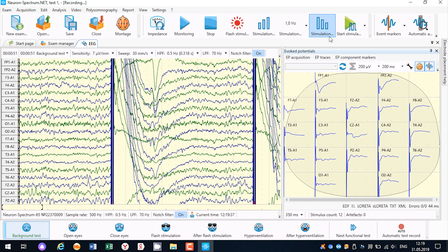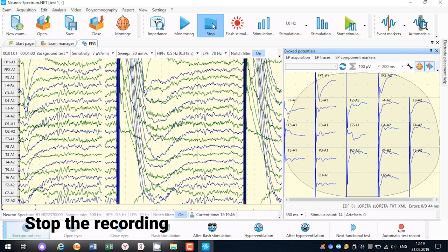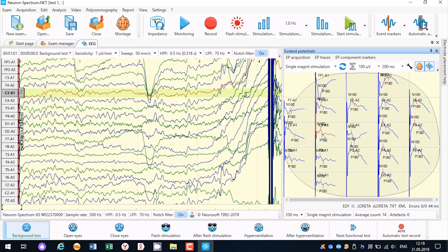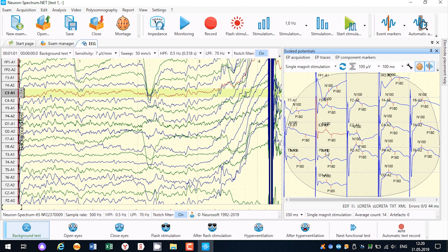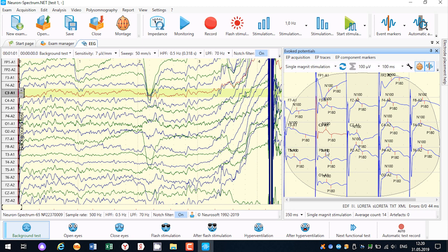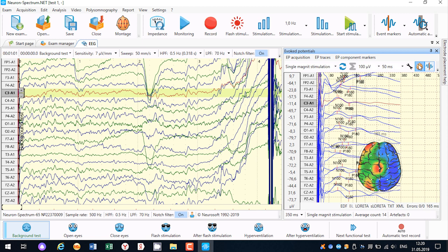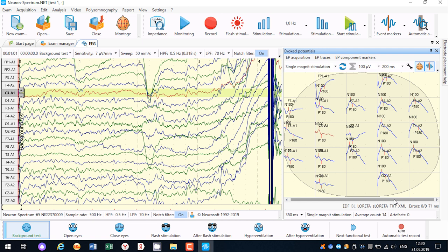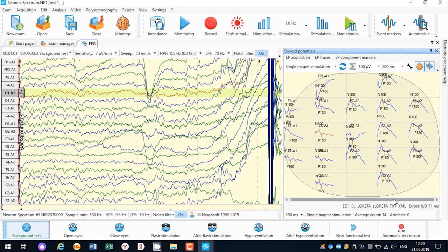You can change the scale for better visualization. Stop recording — markers will be placed automatically. Usually, the best visible peaks are N100 and P180. You can view the results in various ways. To close the exam, press the appropriate button and press the save button.